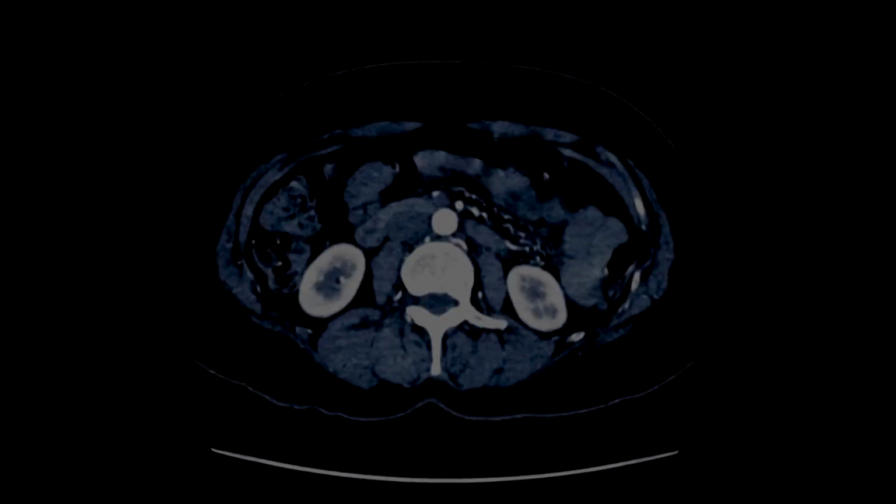Once we get to a certain threshold, we see even lower intensity brightness. Almost nothing, almost like a blackout. That could be really inflamed, something filled with water. Water shows up as very low density on a CAT scan, and that's what the AI is looking for. It's looking for that type of differentiation. So the lower the density, the more inflamed, the more dangerous the plaque might be. When we look at it from a pixel and pixel standpoint, that's what AI is telling us.